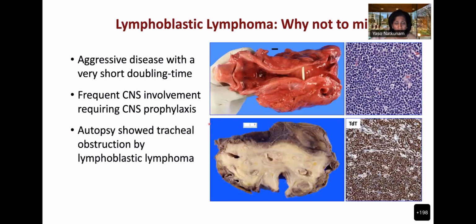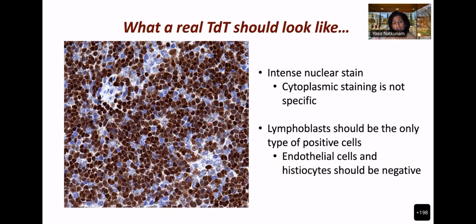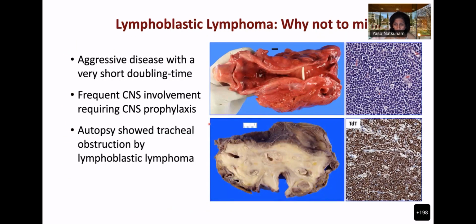Newer markers are coming out that we are testing as well. And so we may actually end up having a good TDT that doesn't have background staining, but it often does have background staining. Okay, so I'm just going to show you some slides from that autopsy.